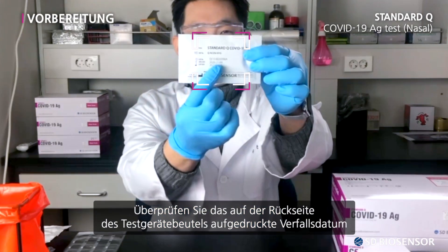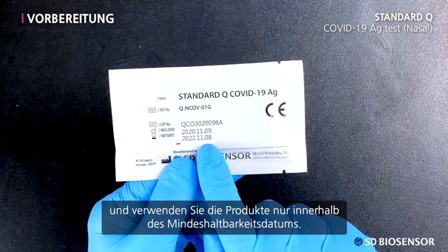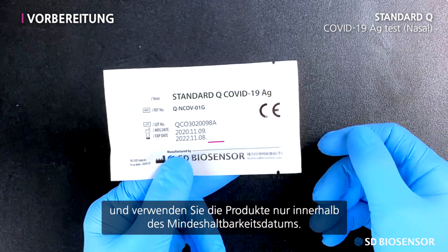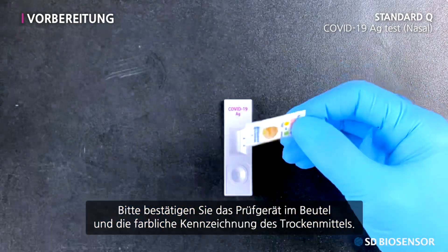On the back of the test device pouch, confirm the printed expiration date and only use products before the expiration date passes. Please also confirm the test device in the pouch and the colored signature of the desiccant.